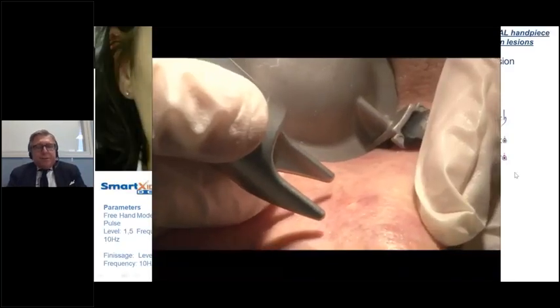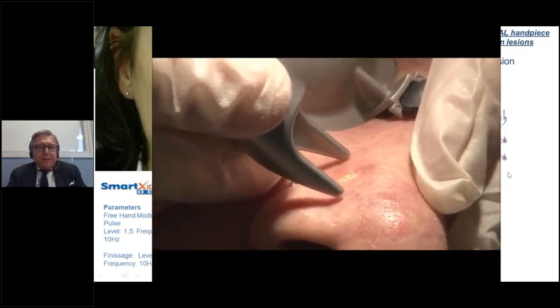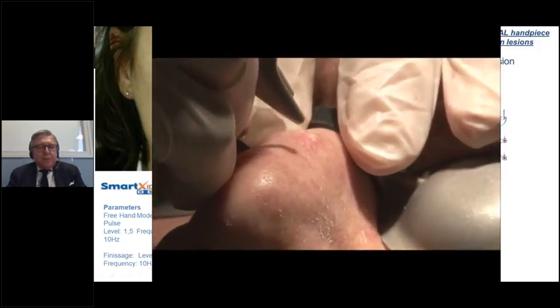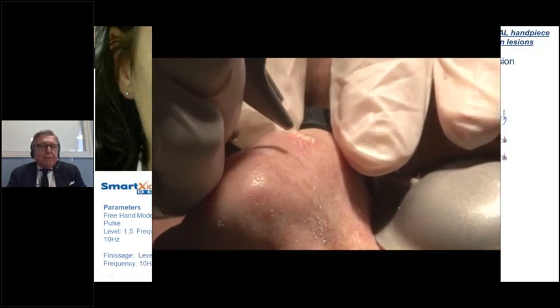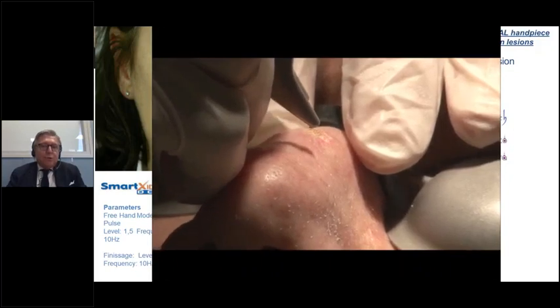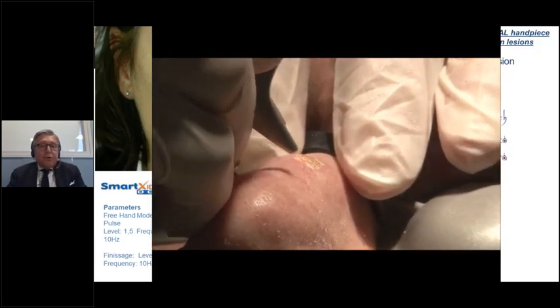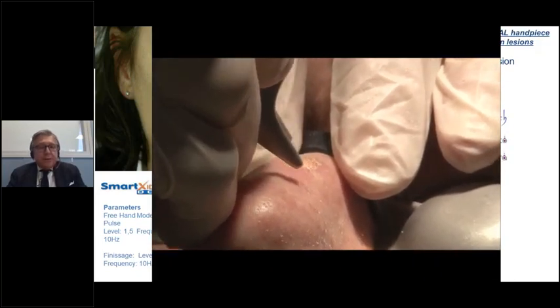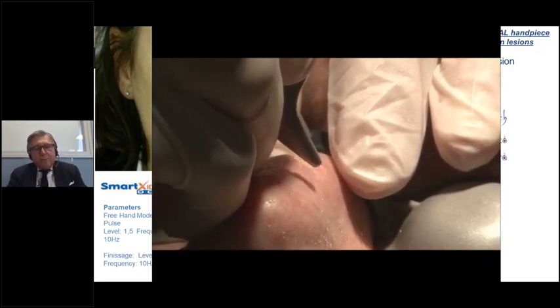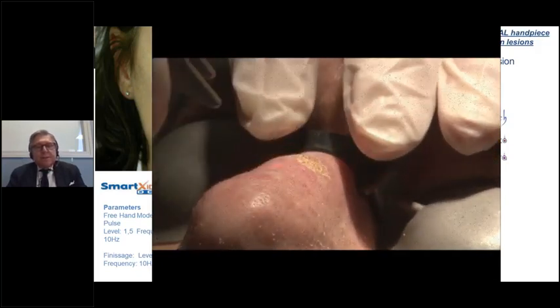This is a video. You can see here skin that is not terrible with the sun damage, but we have some actinic keratosis and the capability to vaporize in a very superficial way by using SP pulse. We vaporize and pass 1 time, then we remove the necrotic debris with wet gauzes, which is very important. You see the capability to cover an area where we can see some discoloration with some damage, some hypochromia, and it's not so terrible, but it's definitely sun damaged skin.